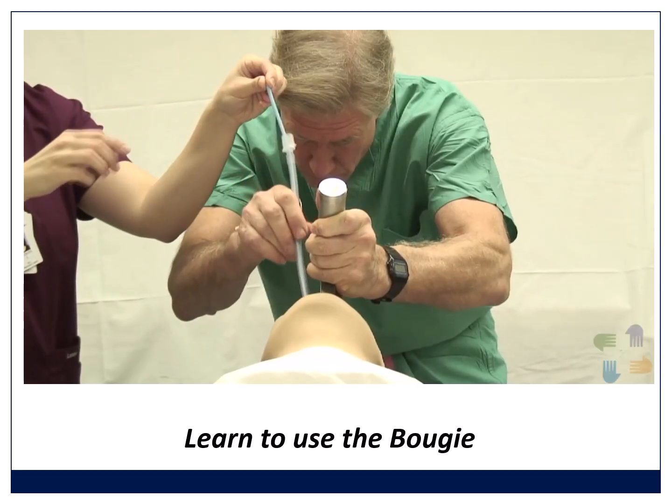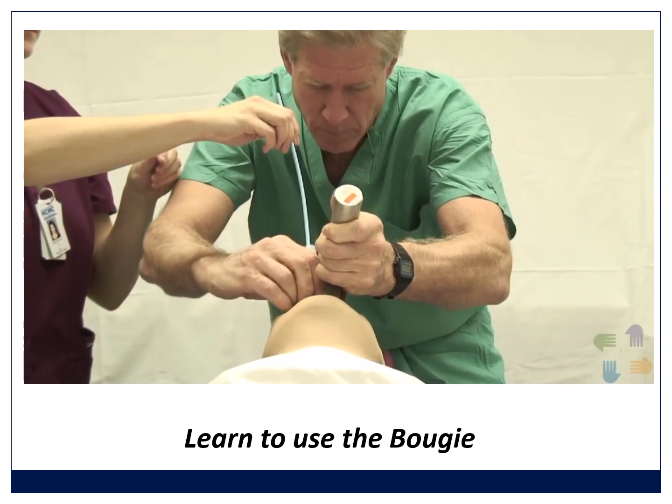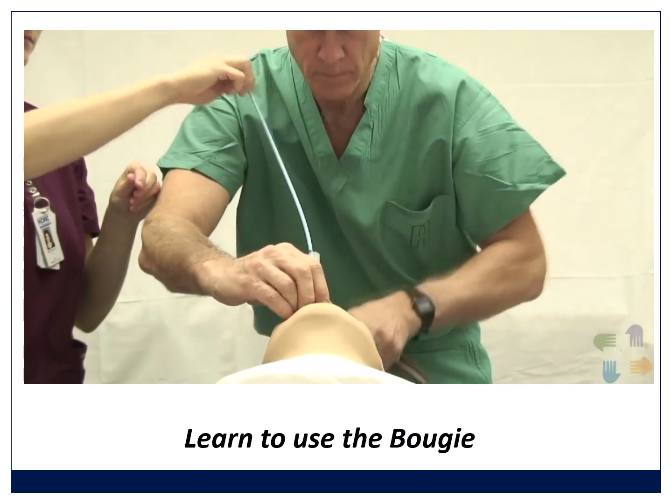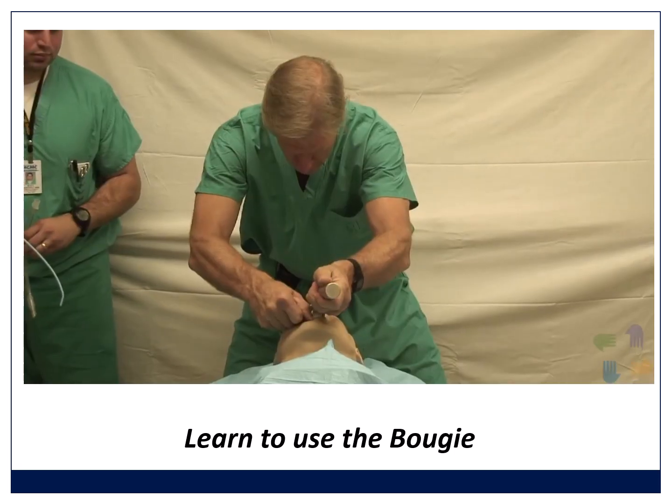As he's pushing that tube in, watch him rotate it anti-clockwise. And that's what helps it get over the arytenoid cartilages. He then takes the laryngoscope out and out comes the bougie. That's a technique worth learning. I want to show that again.